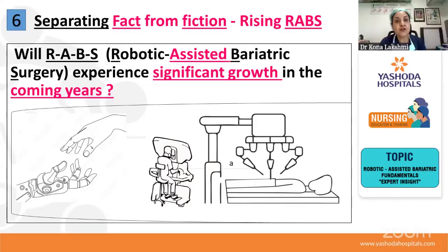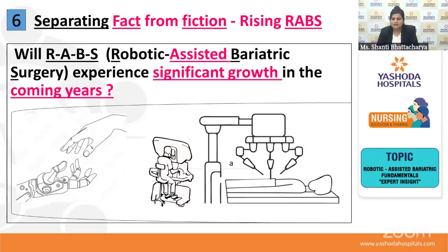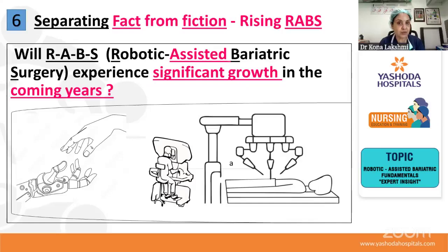So the instruments used to bend, and once the instrument bends, the control on the instrument becomes less. You're trying to hold something and it may slip off. It could be a blood vessel, which means the patient can bleed. You're trying to stitch two intestines together, and your needle holder is not able to drive the needle properly.